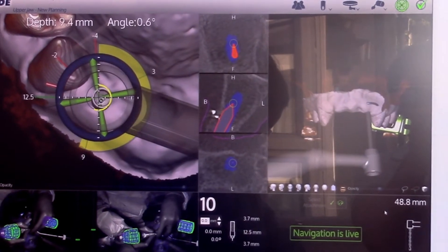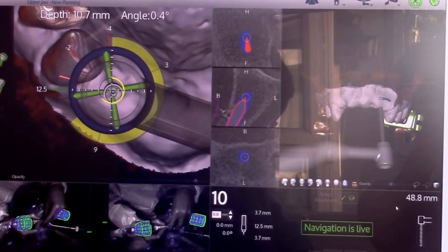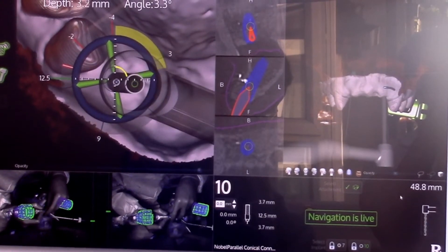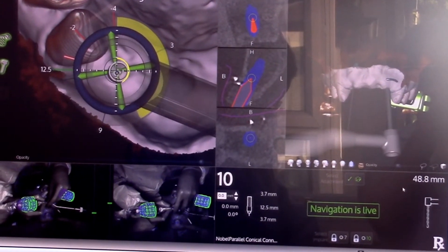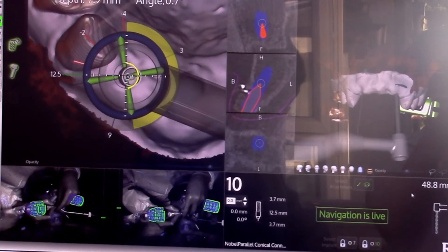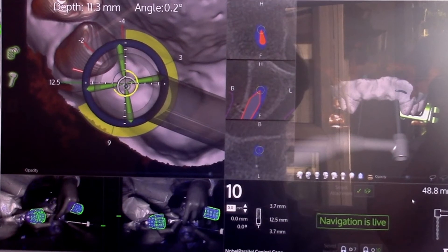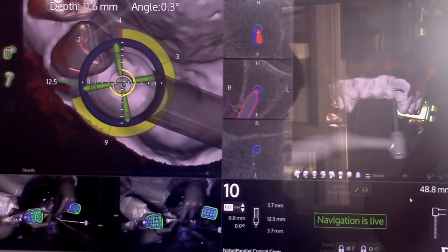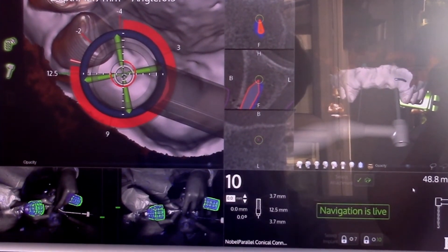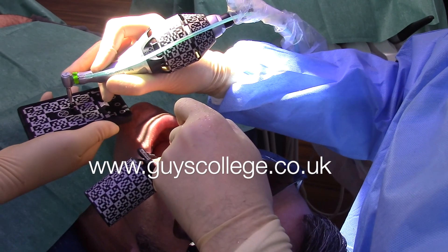I'm beginning to drill down now to the depth of the osteotomy, keeping my angulation fairly centralized. As I get to the full depth, the system will begin to alert me by changing from yellow to green, and then as I drill a little bit deeper — because this is a Nobel system and the drills should be drilled a millimetre longer than the implant — it begins to turn red, but it also shows me that one millimetre length. I can then change to a different drill and continue the procedure until I have placed all the implants.